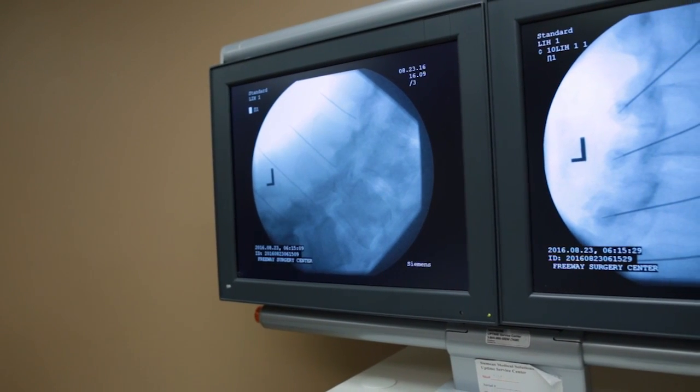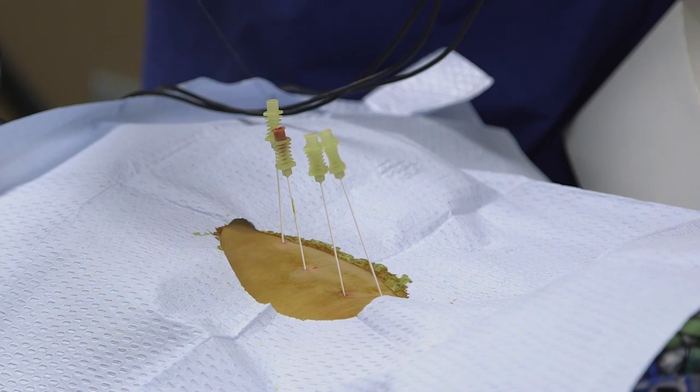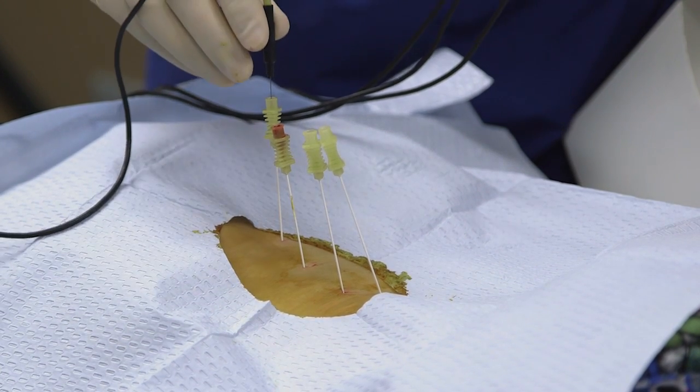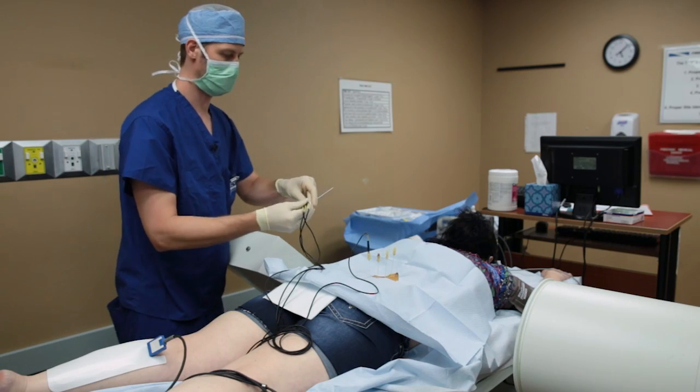After getting the needles in the right spot, we're going to place the metal probes through the needle. These probes will heat up the tip of the needle that's now placed by that nerve that we're trying to destroy.